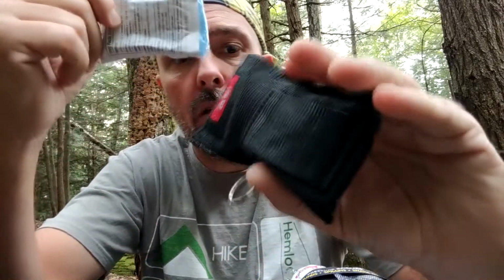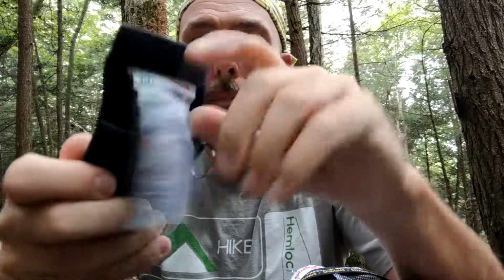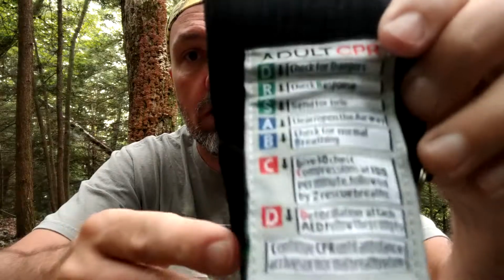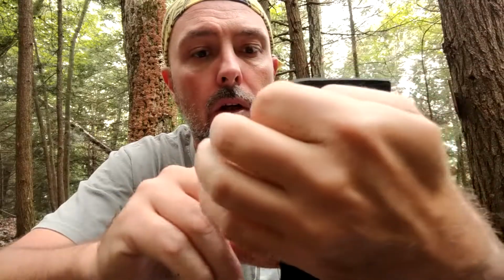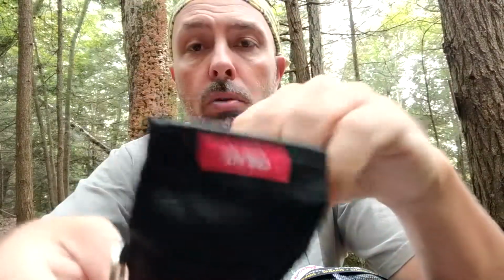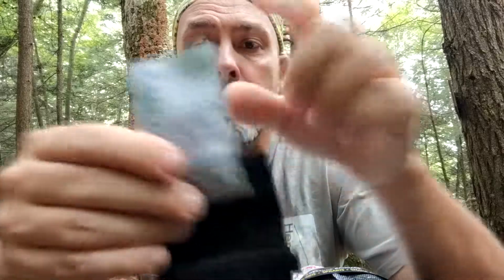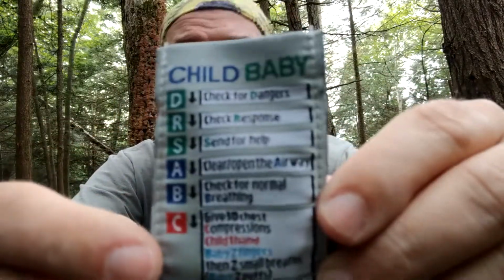So in here, there's actually a little pull-out flap that gives you basic instructions for CPR, what you should do. Of course, if there's somebody who's trained in CPR, you would want to have them do this. But in an emergency, if it could save somebody's life, these are good instructions to have. So you got one side for adult and one side for child.